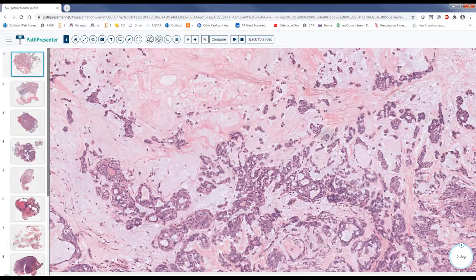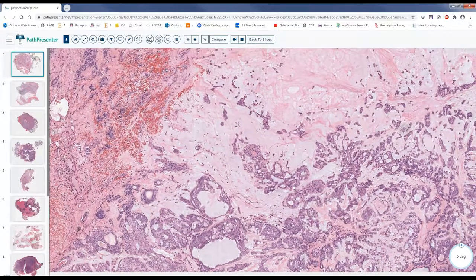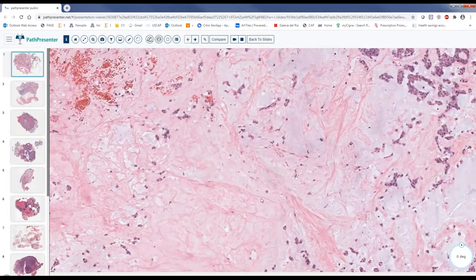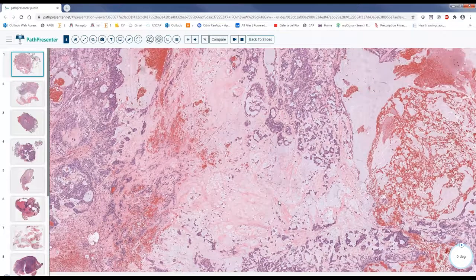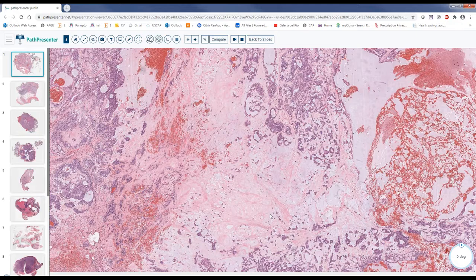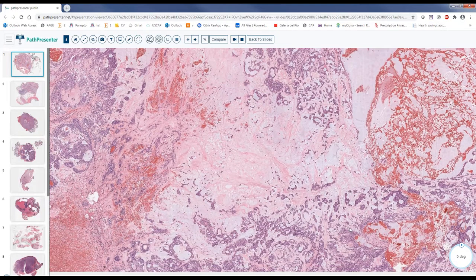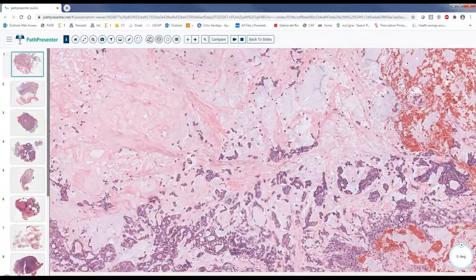Both of them are fantastic, and you'll see some areas with a kind of bluish hue, with a mix of some cells here. These are the myoepithelial cells, and this is like chondroid. And actually, you should see that from the gross examination. Just 2 days ago, I got a frozen, and once they cut it, I asked the resident, what's your differential diagnosis? And he told me, oh, there's a myxoid area, thinking of pleomorphic adenoma. Okay, so that is how we go to this.